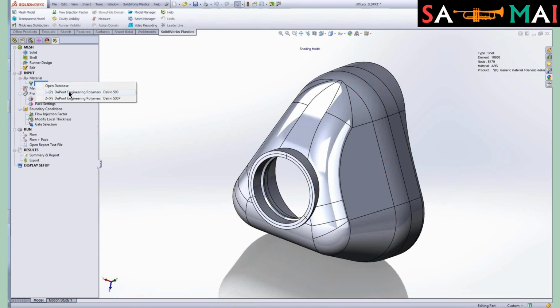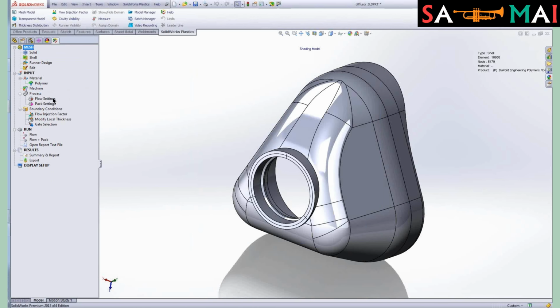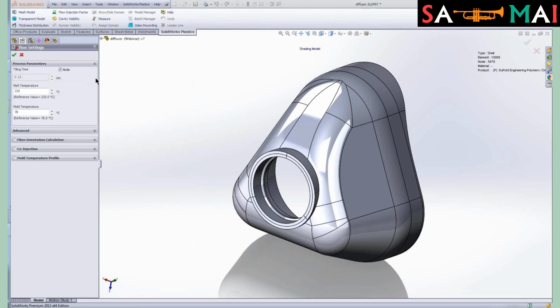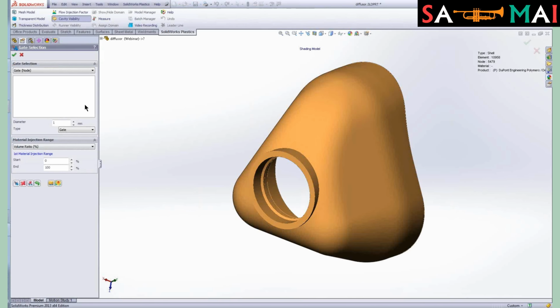And we'll choose the same polymer as before, Delrin 500. Choose the same molding machine. Here, let's go ahead and change, see if we can inject the plastic a little bit faster than the recommended time. This would be important for trying to optimize our cycle time. And then as I mentioned, we're going to do multiple gates. So we're going to put in 3 small gates.